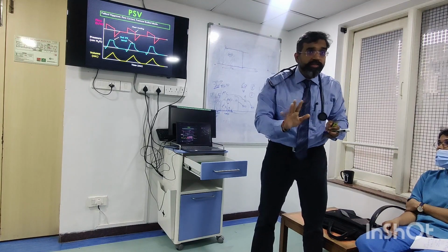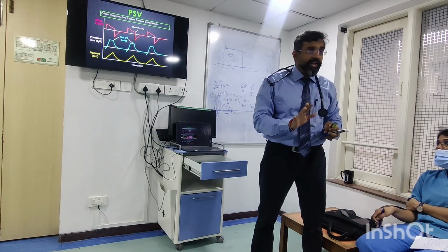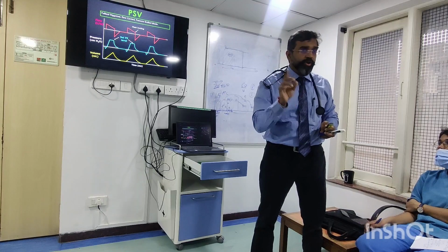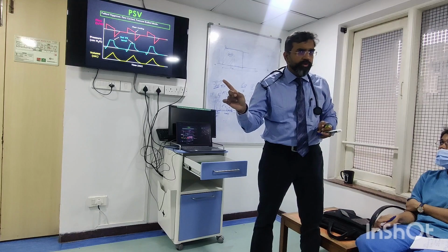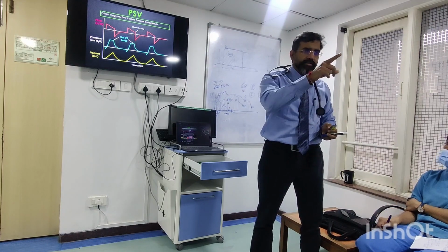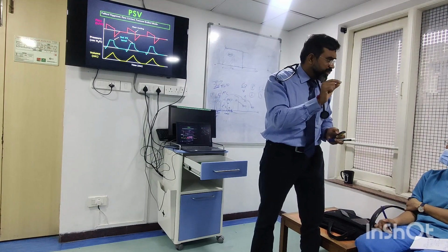We may not want to alter this anytime. In some modes, in some ventilators, flow cycling can be changed. Not in all. Our machines you can't. When the Hamilton comes, look at it. I'm getting the Hamilton tomorrow. After the mechanical ventilation workshop in Sion, the machine will come here. In that, there is ETS, expiratory trigger sensitivity. You can change it.